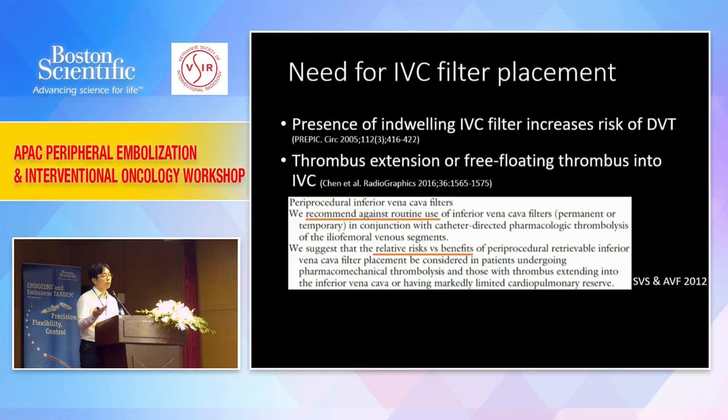The next thing will be a talk about IVC filters. Okay, we know from trials long ago that if you have an IVC filter in situ over a period of time, they in fact increase the risk of DVT, right? It's good for the short term, but then it gets worse in the long term.